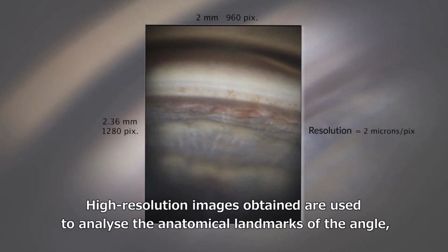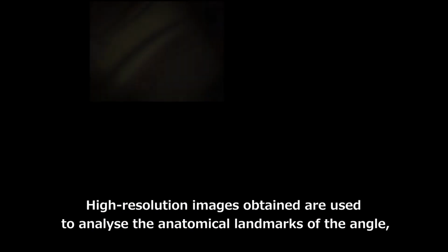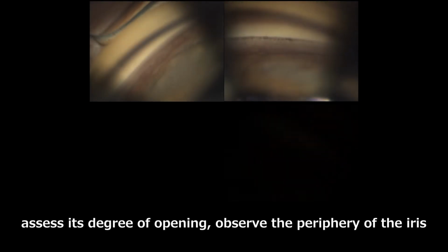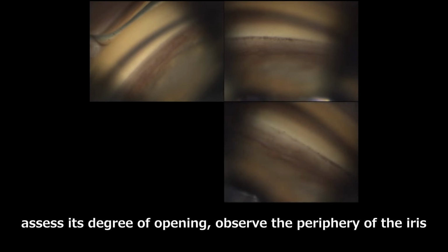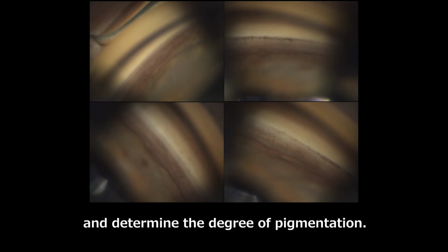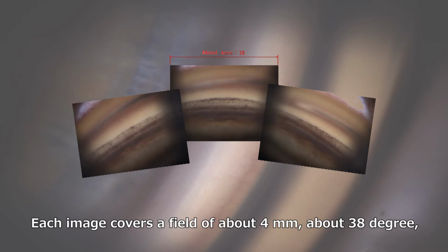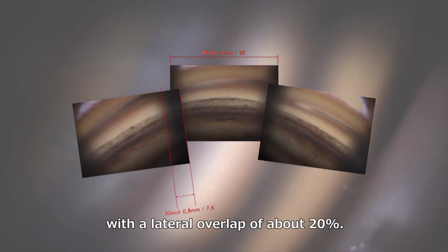High-resolution images obtained are used to analyze the anatomical landmarks of the angle, assess its degree of opening, observe the periphery of the iris, and determine the degree of pigmentation. Each image covers a field of about 4 mm, about 38 degrees, with a lateral overlap of about 20%.